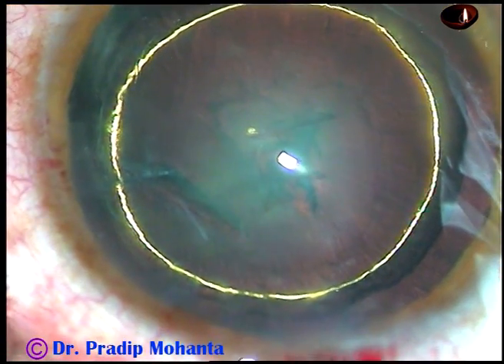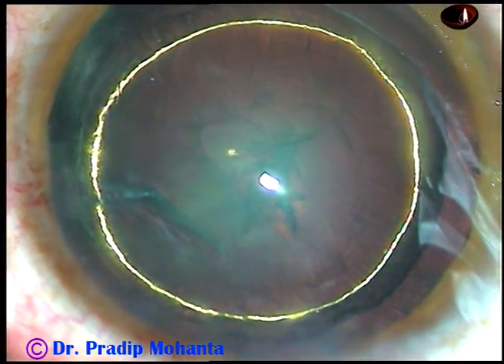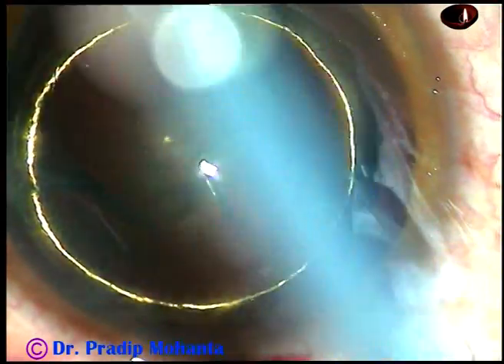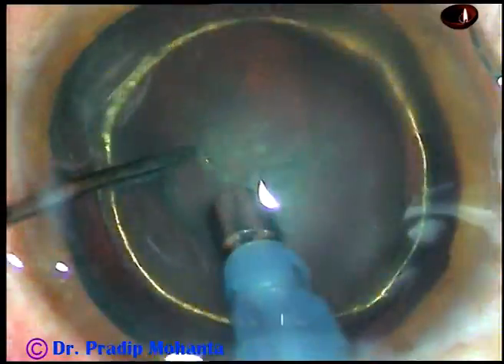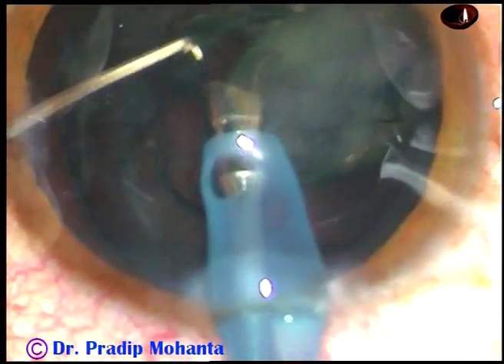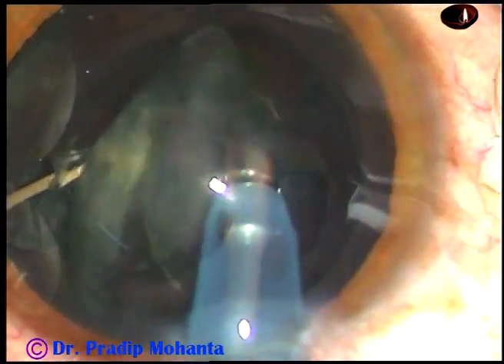This is a very soft cataract. Nucleus sclerosis will be grade 1 or 1+. And now the tip of the FACO handpiece is introduced. In this case, my plan is to remove the nucleus within a few seconds — just tilt it and emulsify it within few seconds.